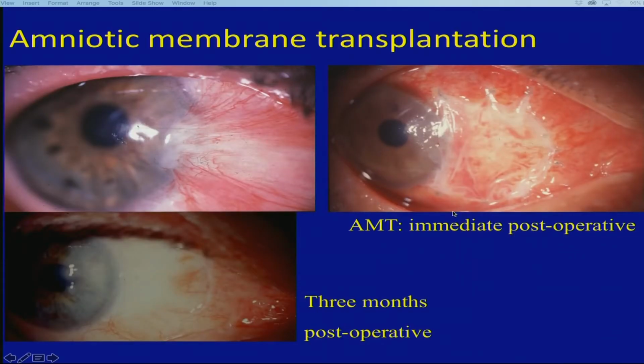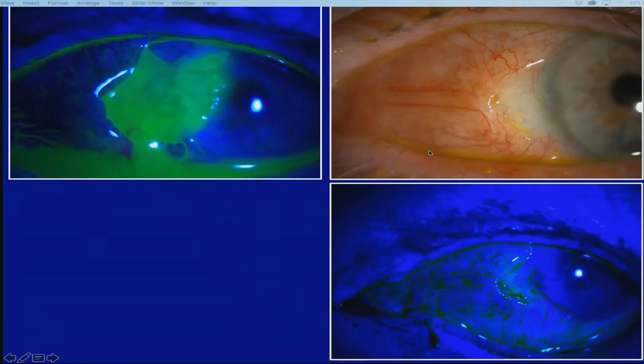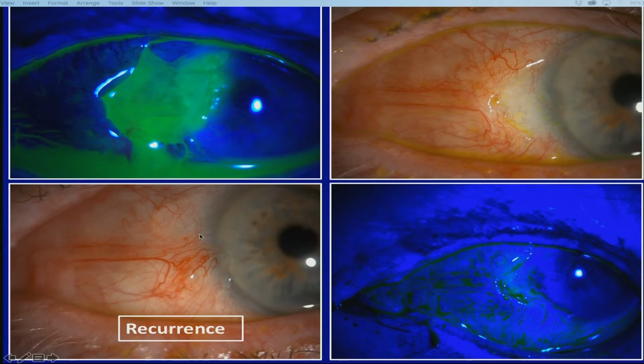So when do you use amniotic membrane? We use amniotic membrane very rarely in pterygium surgery, only if you have a very big epithelial defect. If you have, for instance, a large pterygium with a nasal and a temporal head, it is recommended now that even if you have to use amniotic membrane, you better use a small part of autoconjunctival graft and stick it on top of the amnion so that you don't leave a large bare area, because it's a much higher recurrence rate. And this is an example of a patient where I had to use amniotic membrane, and you can see here the patient 2 weeks after, and then within a month the patient had a recurrence.